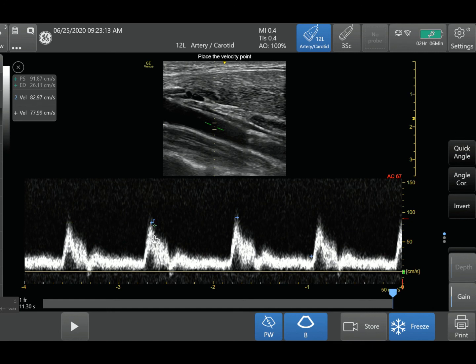So we just went over wall filter, steering for color mode, and angle correction for pulse wave Doppler. These might not be the most common or most basic settings, but as you can see, they can make a very big difference if you need them and if you really want to optimize your Doppler settings.